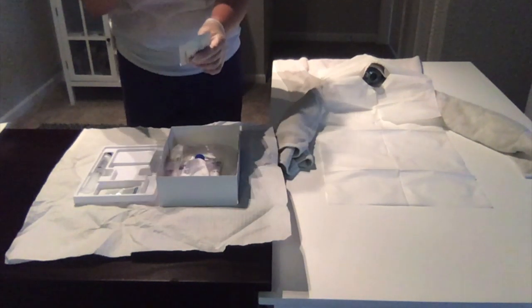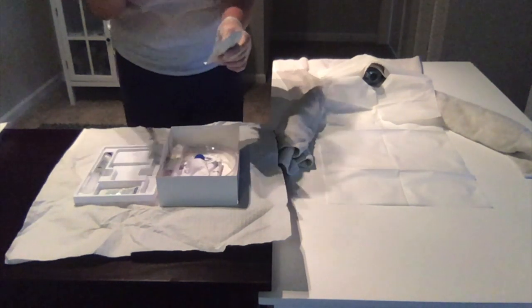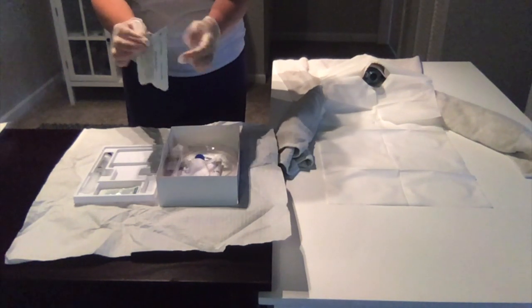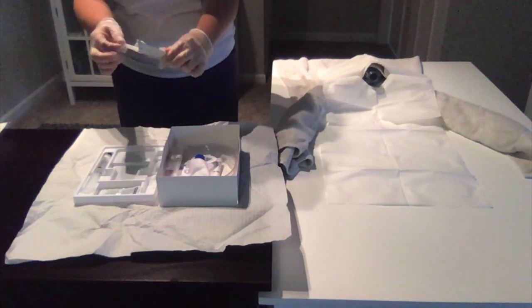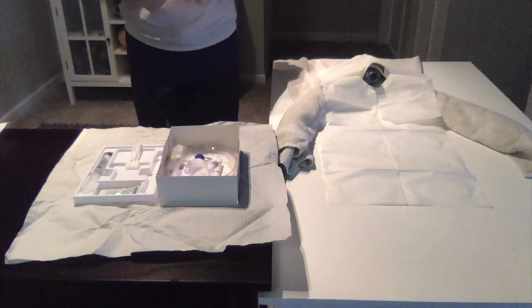This I can do the same, or this is the name and the information. I can go ahead and I'm going to put it on this, but maintaining the height. I'm going to open these up and take these out, and place them on my sheet, also maintaining height, dropping it waist level.